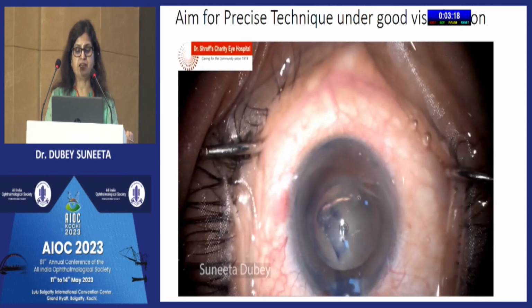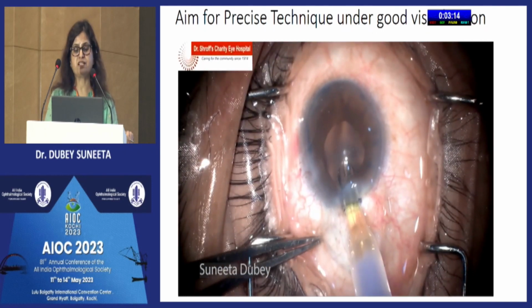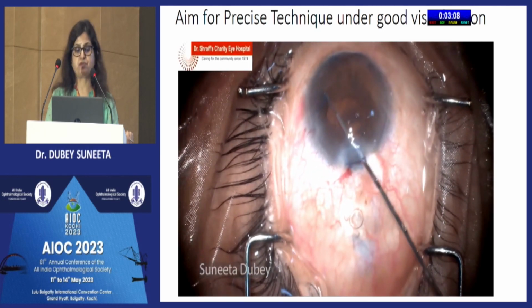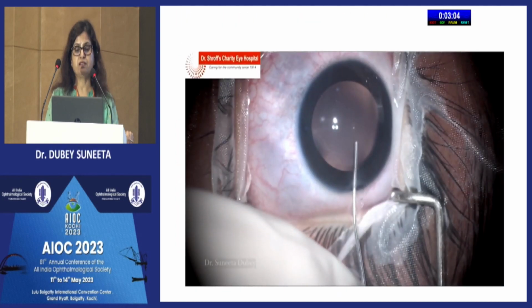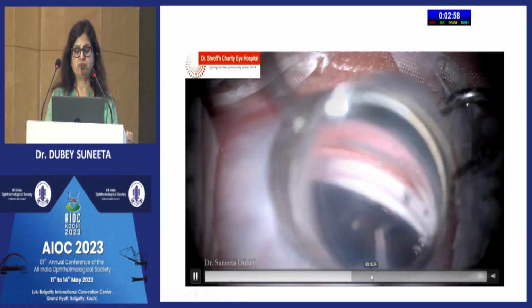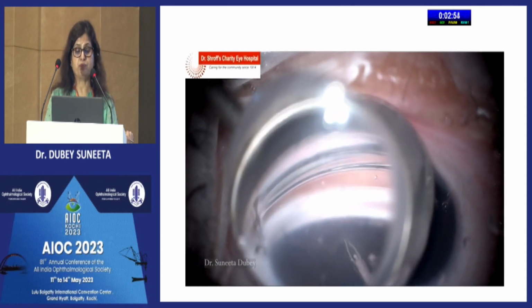After the KDB blade or bent needle, you can finish off your cataract surgery and then remove the strips. You can remove the strip as in this video, after completion of the procedure, with the help of this micro forceps.